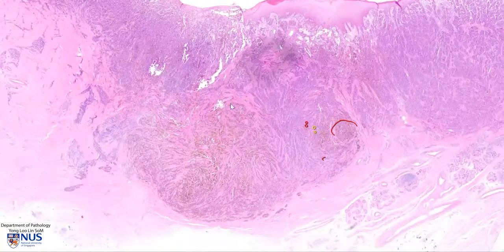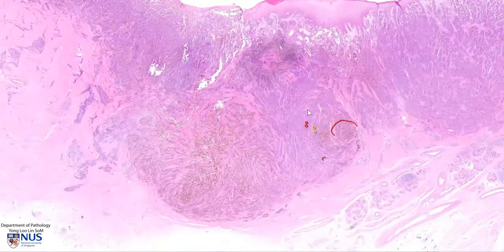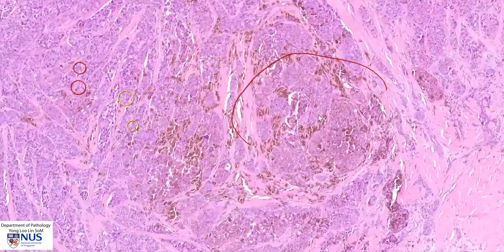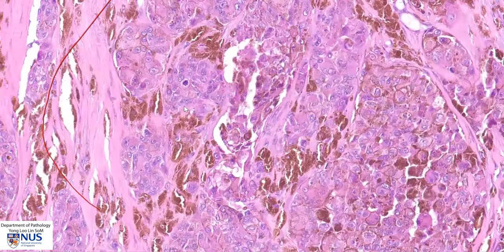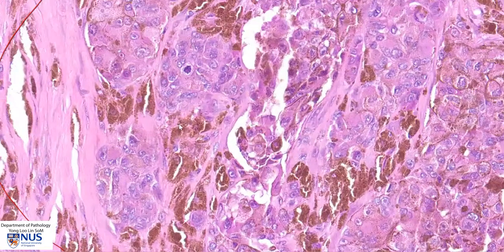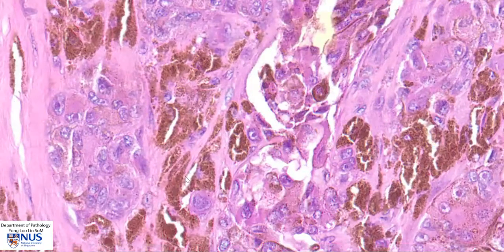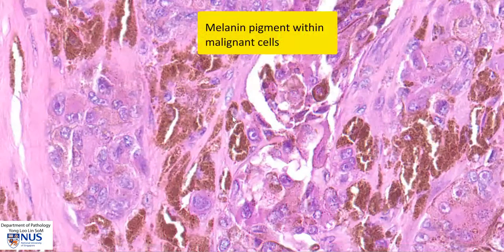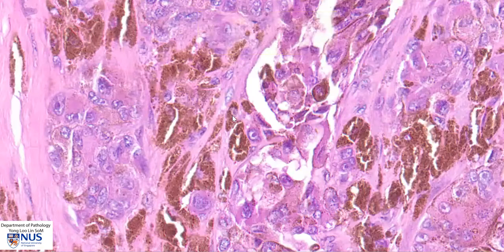Let's look at the area of deepest invasion. Taking a closer look, we can see that some of the melanoma cells have this granular brown pigment within the cytoplasm. This pigment is melanin, and while it is not seen in 100% of all melanomas, it can certainly be seen in many cases.